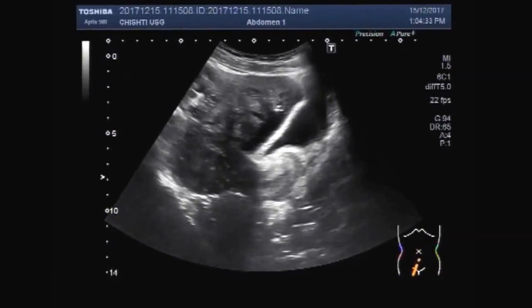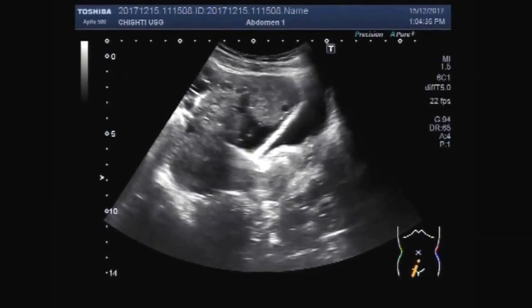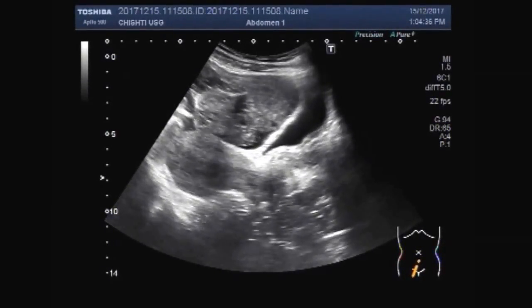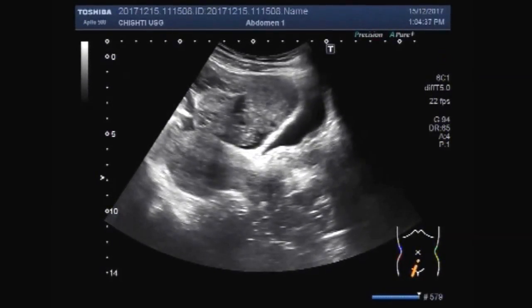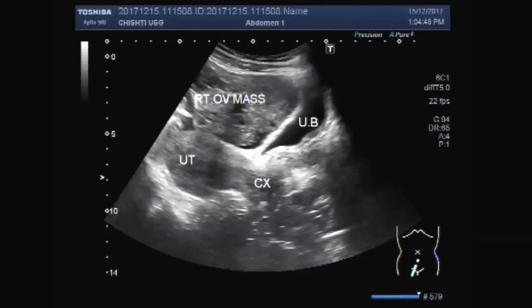You can see the uterus is empty. No mass, foreign body, or sign of pregnancy seen. This is your bladder and this is the right ovarian mass.